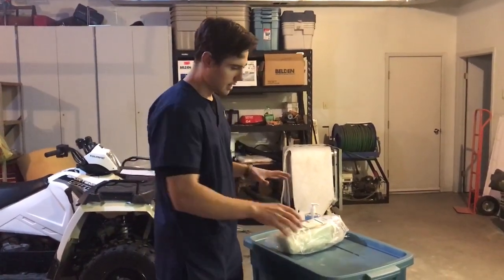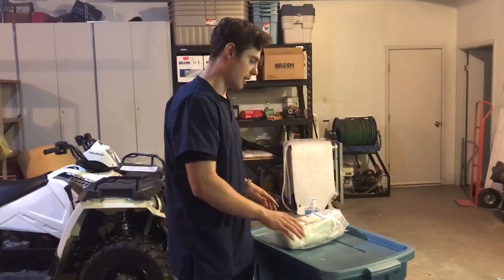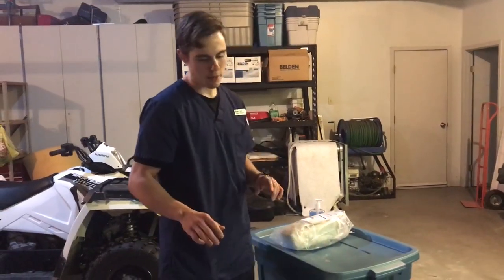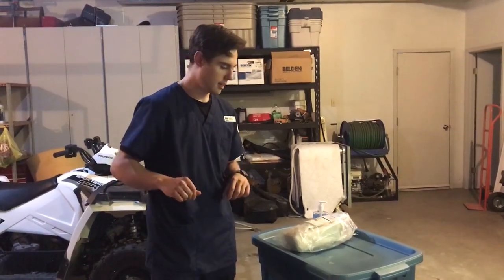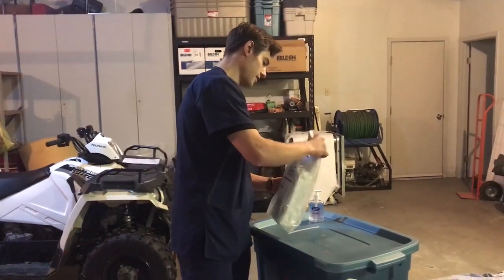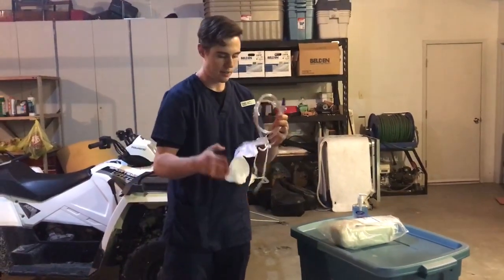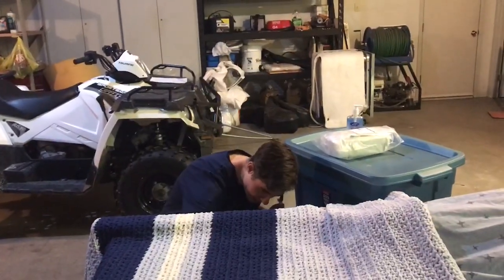Then I'm going to adjust my bedside table, so I'll raise that to waist height. I will clean the table off and put it into the appropriate position here, close to the bed. Then I will raise our patient's bed to waist level as well. After that, I'm going to pull out our drainage bag. So we'll throw that in the garbage there. And I'm going to hook our drainage bag on to a non-movable portion of the bed.